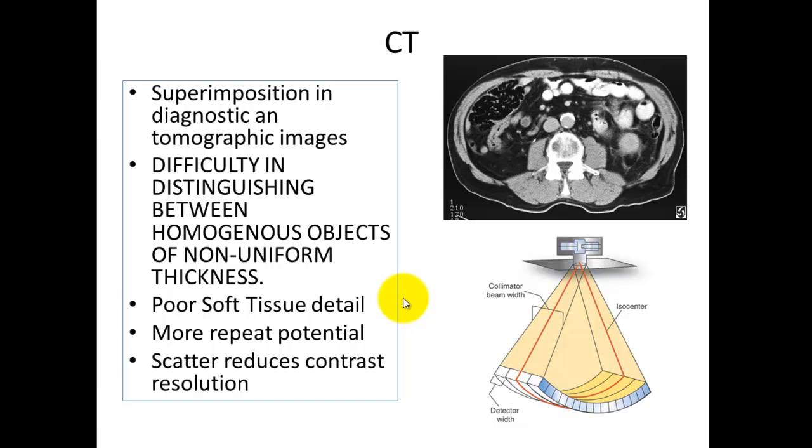Whereas in CAT scan, we can see very small attenuation differences that are less than 1%. Believe it or not, that may sound good, but that is a world away from nuclear medicine, where we are seeing objects at a molecular level that show up as a hotspot on an image that would never materialize on a CAT scan.